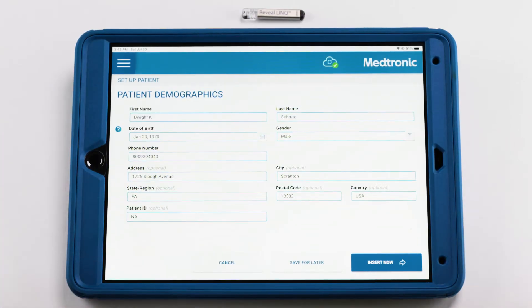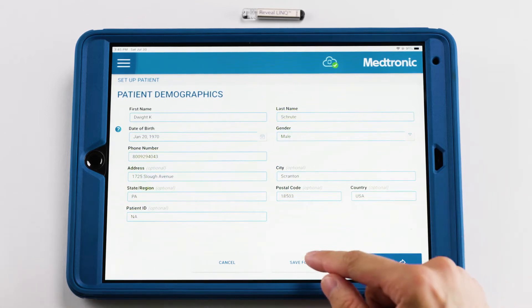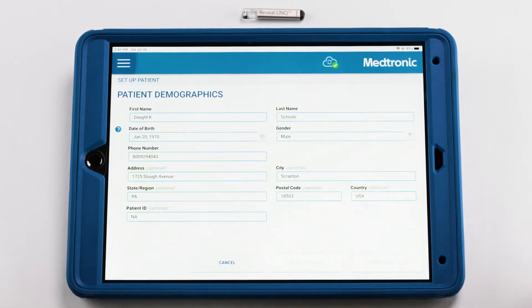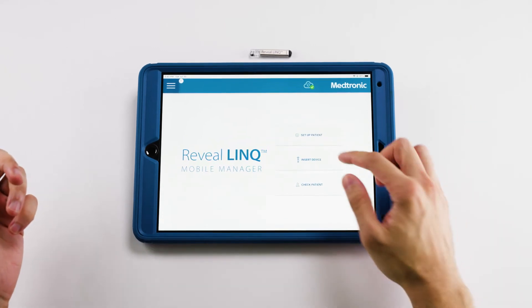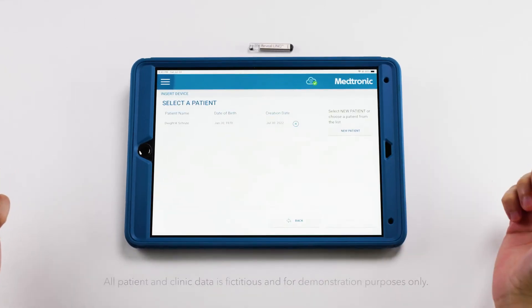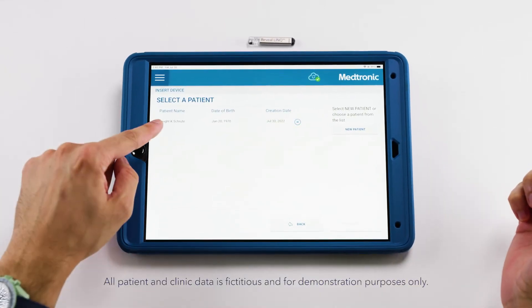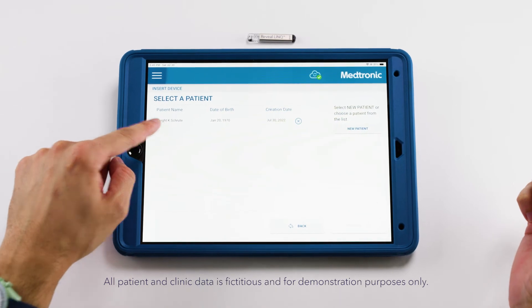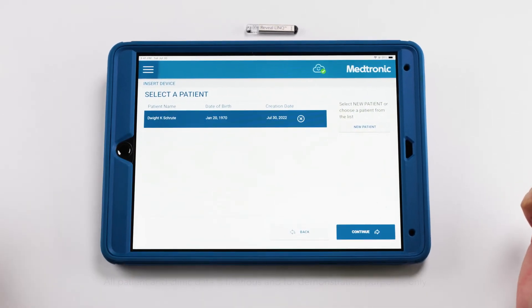Now that we've completed all of the fields, we can save this information for later and retrieve it on the insertion date. We've arrived on the day of insertion. We're going to click Insert Device and, as you can see, our preloaded information from prior will be located here.